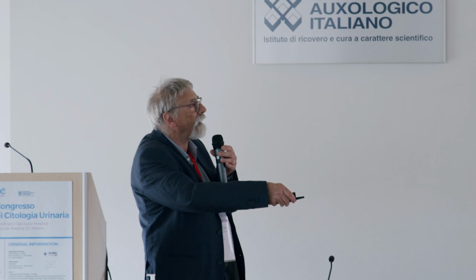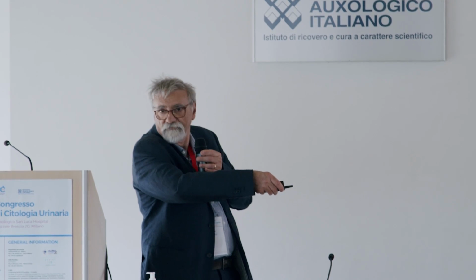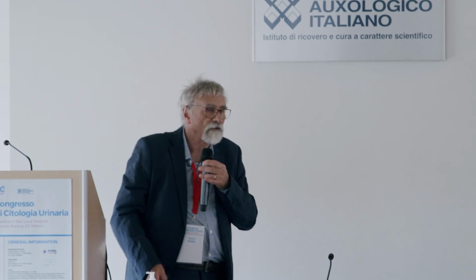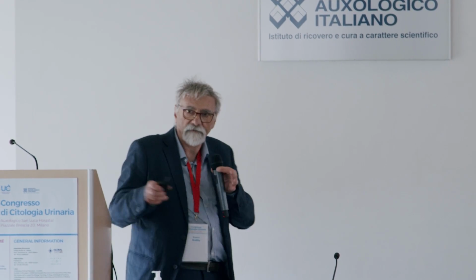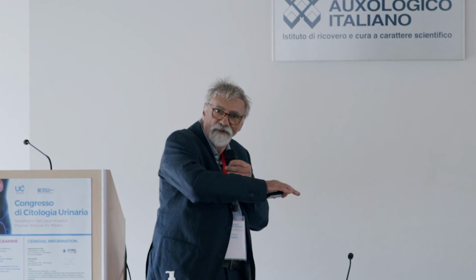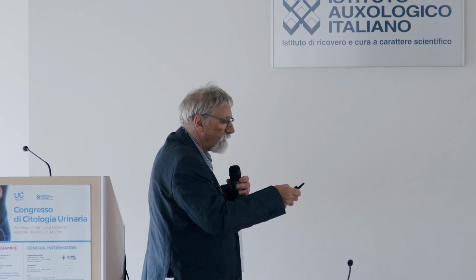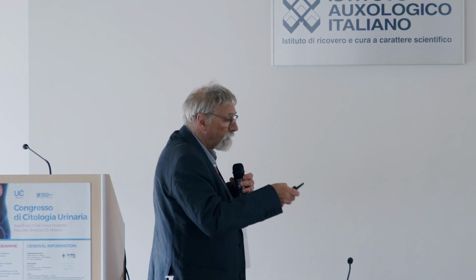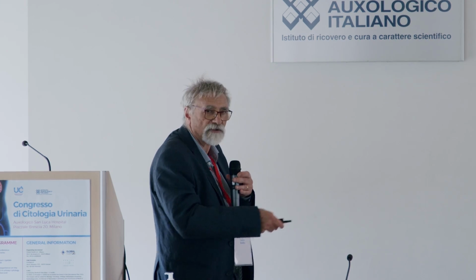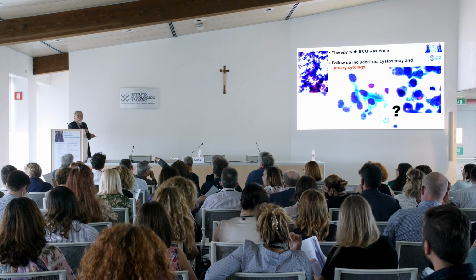Negative for high grade on the left, and on the right, AUC today. The time of changing from the old system to the new system is not so easy. So the question of Dr. Gazzano about the mucus has a reason. You have to point to it.